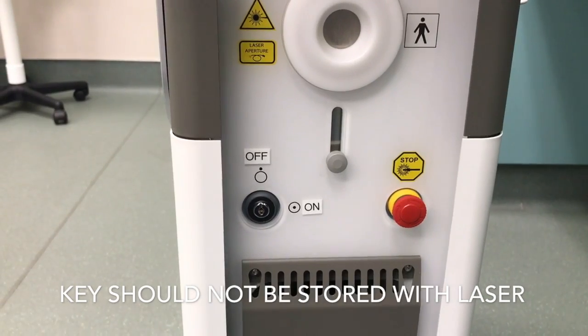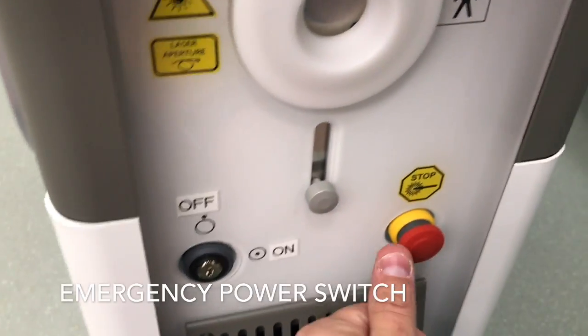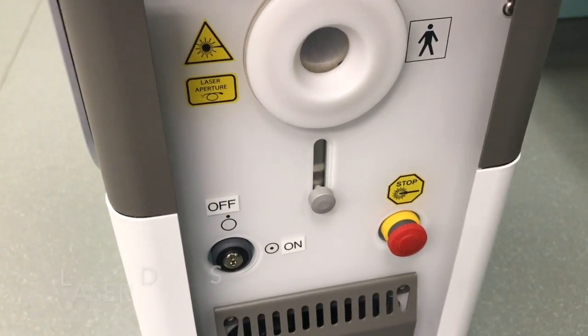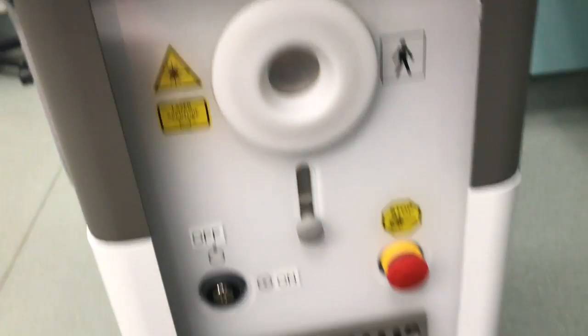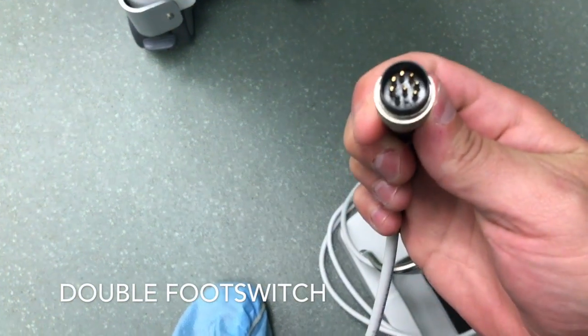On the front of the laser we have a key switch that allows you to turn the laser on and off, and an emergency power switch — to use it, click on and turn to the left or right and it will pop off. We have the door for the laser fiber, which just lifts up, and then you can plug in the laser fiber.